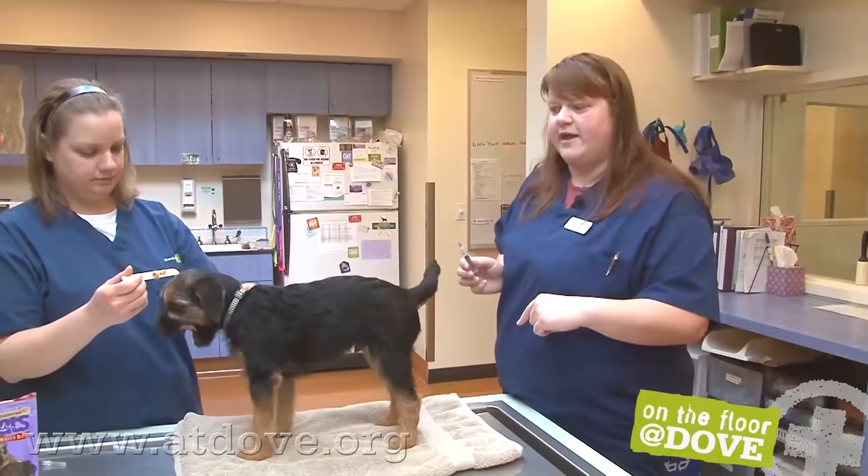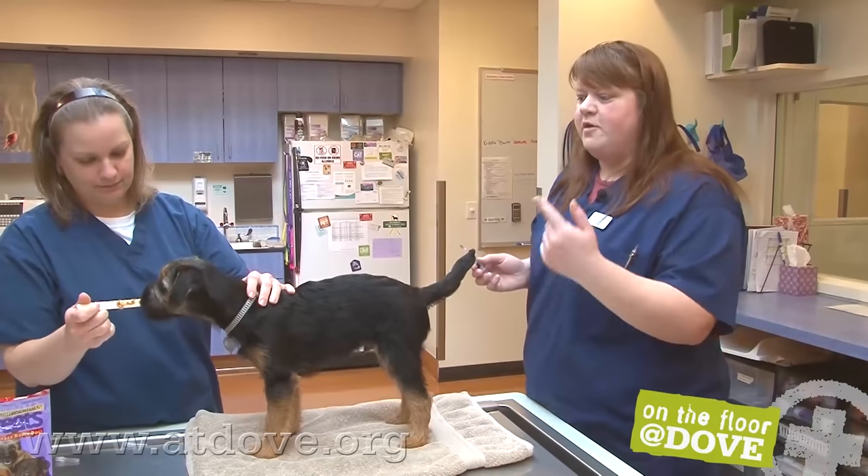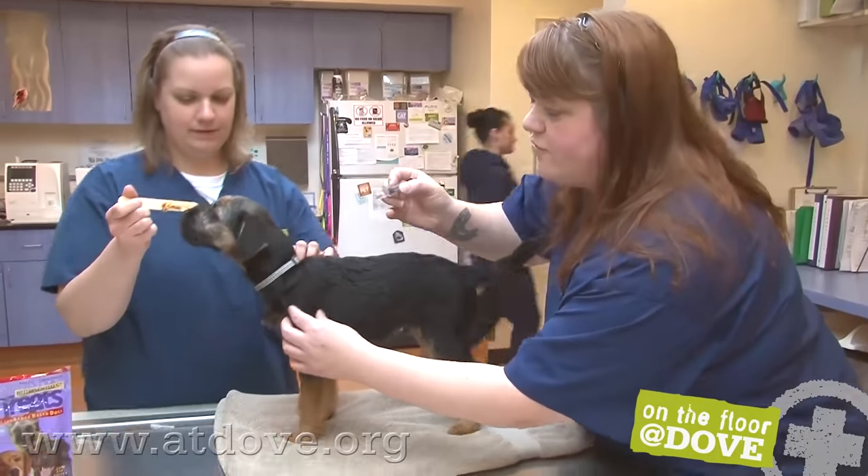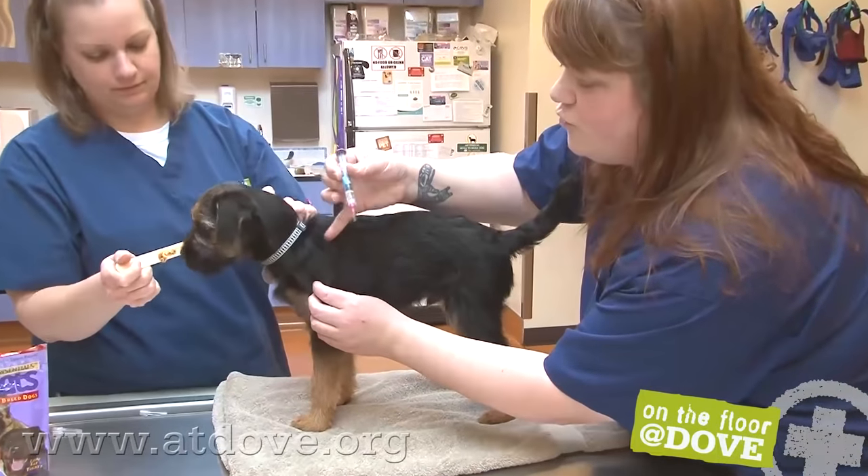Now we're going to do the Bordetella and we're going to be on the other side. Megan's still distracting him, and all the vaccines go sub-Q. We're just going a little bit lower than his shoulder area.